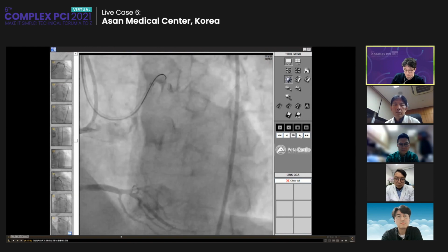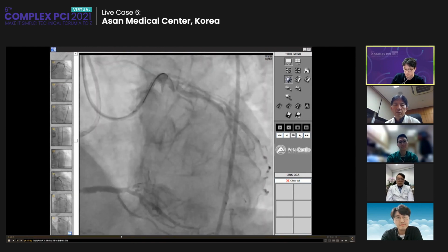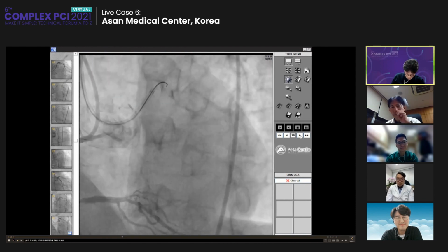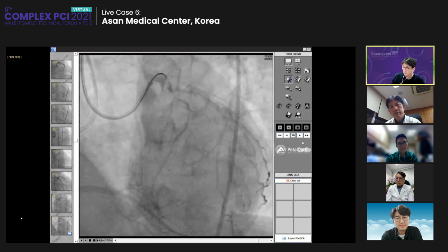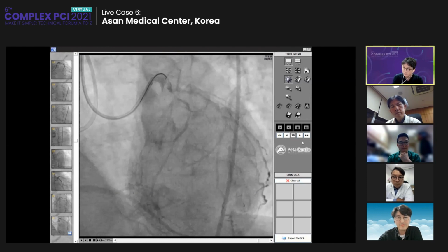I think it's worth discussing why they failed, and how to plan my strategy so as not to repeat the mistakes of their failure course. Okay, this was a previous angio, and I think we have lots of things to say, especially for our fellows and CTO PCI beginners. So, Master Dr. Barma Sensei, do you have any comments?